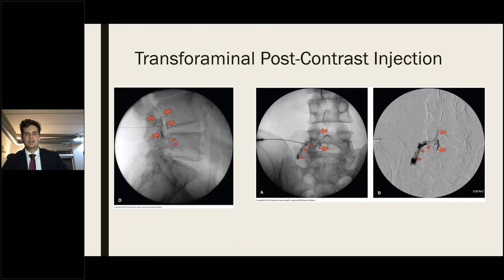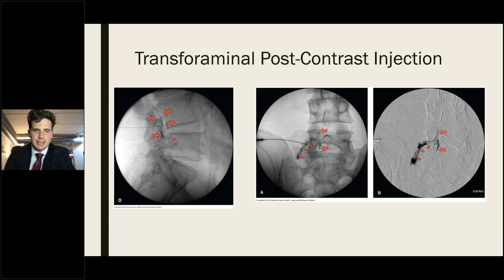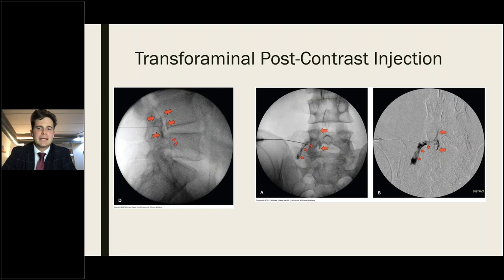Contrast images for transforaminal epidural show contrast within the central epidural space with both posterior and anterior spread. The second image outlines the nerve root with contrast moving from the nerve root into the central epidural space. Digital subtraction imaging is used to assist in identifying vascular uptake of contrast, and contrast spread throughout the nerve root can be seen.